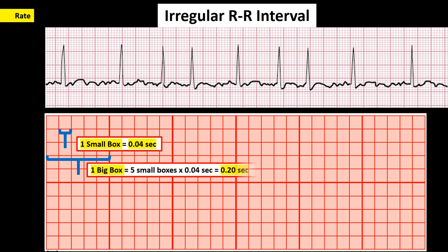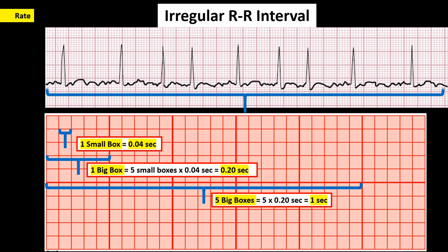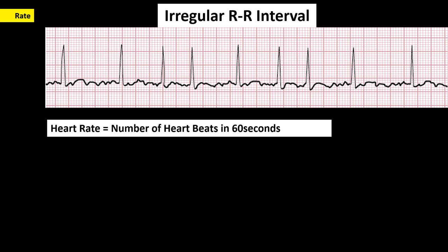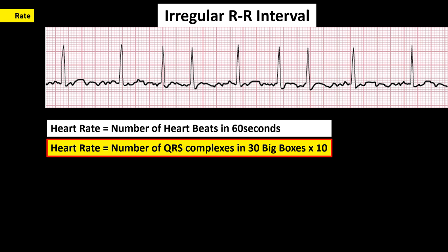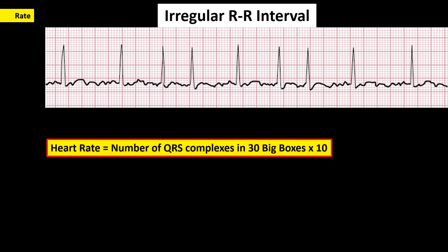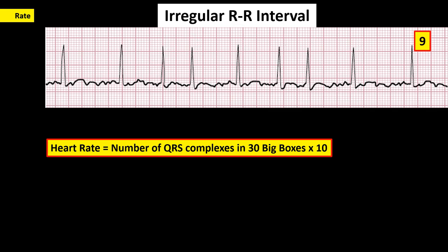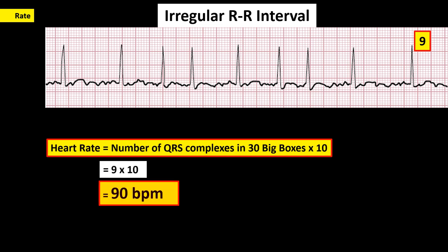For an irregular R to R interval, you cannot use the 1500 formula. Knowing that 30 big boxes equals 6 seconds, and the heart rate is the number of beats in one minute or 60 seconds, we can determine the heart rate by counting the number of QRS complexes in 30 big boxes, multiplied by 10. For example, in this case there are 9 QRS complexes within 30 big boxes, so heart rate is 9 times 10, which equals 90 beats per minute.